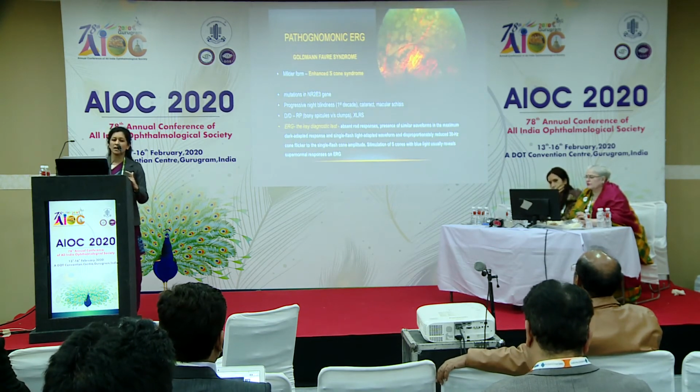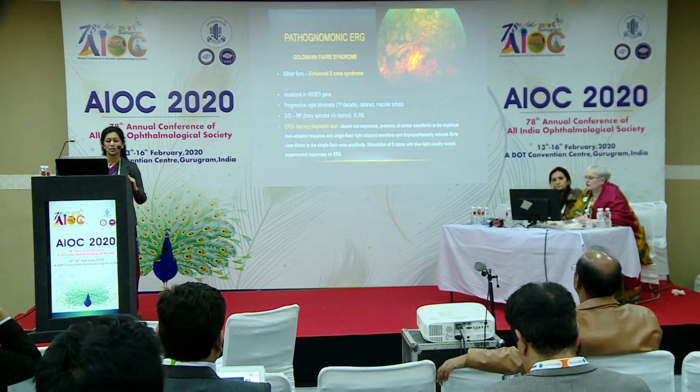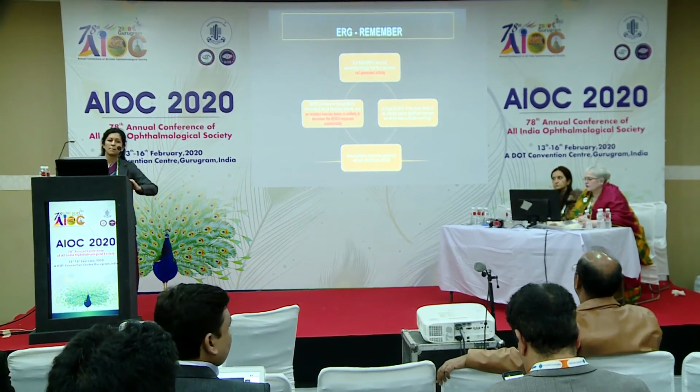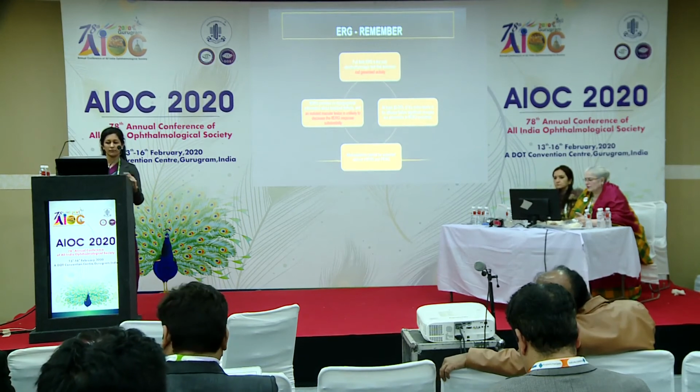Finally, sometimes we have these typical clinical pictures, though they are rare, with pathognomonic ERG like the enhanced S-cone syndrome. So remember that ERG is important whenever you suspect that there's a problem with the rods, and also remember that it's a global response, so that if there's only a macular pathology, your full field ERG will come out to be normal. The next scenario is the kind of dustbin diagnosis we call heredomacular degeneration.